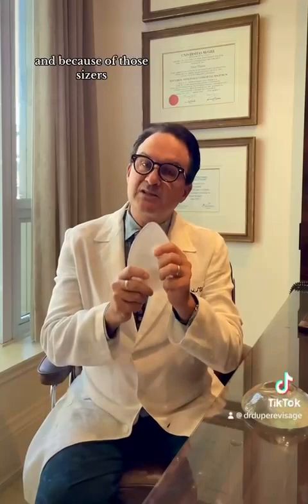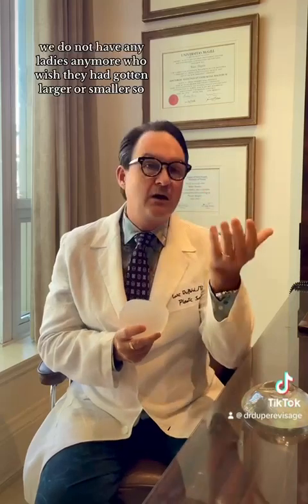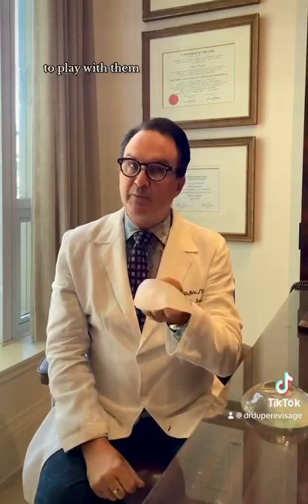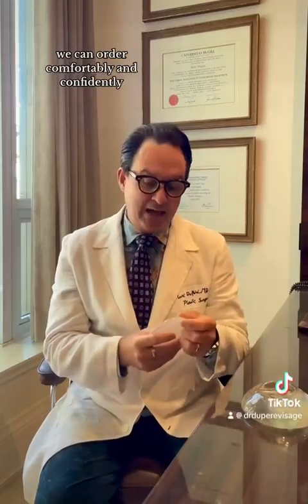And because of those sizers, which come in all sizes, we do not have any ladies anymore who wish they had gotten larger or smaller. So we love our sizers. My patient can spend a lot of time with me and my nurses. They can bring their partners if they want to see them, to play with them. And once we get the size they like in the mirror, we can order comfortably and confidently the final implant size.